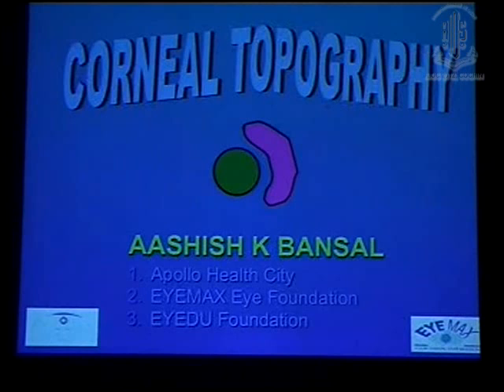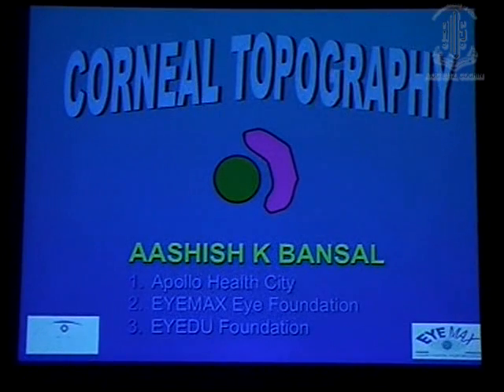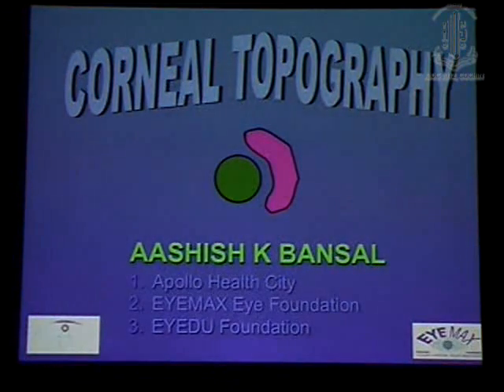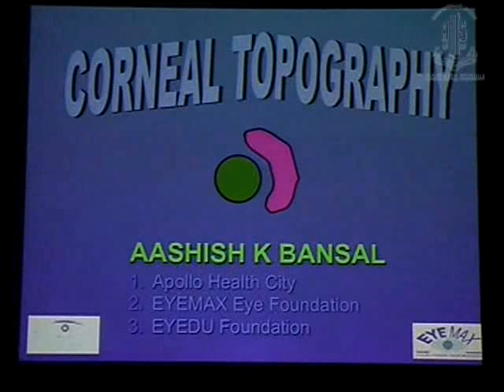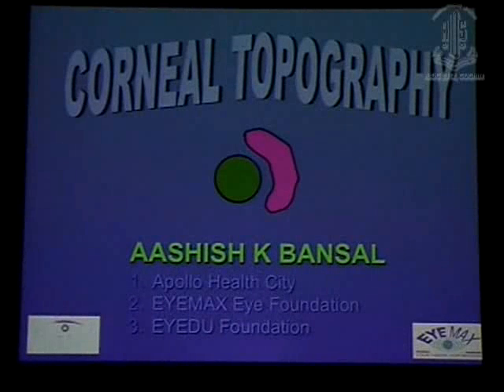Well, corneal topography, we all know, is a measure of the shape of the surface of the cornea. Now, in today's world, measuring the shape of the surface of the cornea has become very important because, as you know, in refractive surgery, basically what we are doing is altering the shape of the cornea. And when we want to alter the shape of the cornea correctly, it's very imperative that we know the shape of the cornea correctly in the first place. So, an accurate measure of the shape of the cornea assumes significance today in the era of refractive surgery.